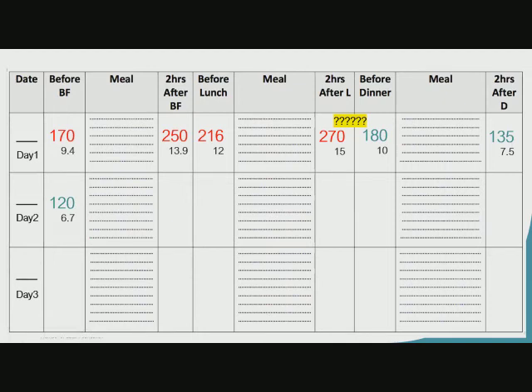He had his breakfast, which had 1 egg, Greek salad, 1 piece of bread, a cup of milk, and an apple, and took his or her medication if taking medications. Then 2 hours after the breakfast, it was 135. That's good. And then a check before lunch, it was 140. That is also good, within range.